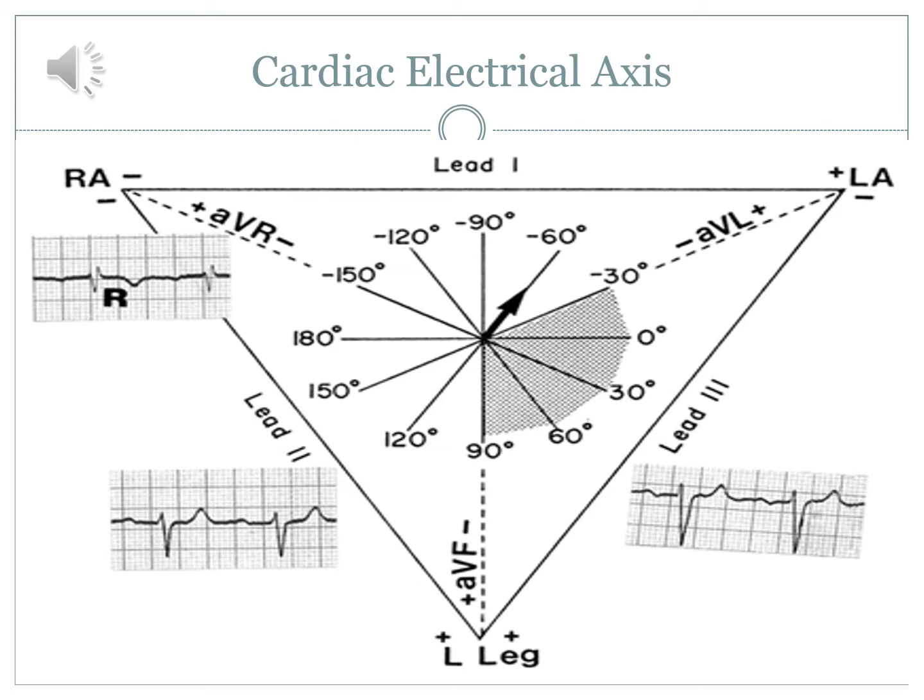Today we're going to look at electrical axis deviation. Now I completely understand that this is an area that most people try to avoid. There are people that have a general understanding. They describe the thumbs up, thumbs down methods, not really understanding what they're looking at with the heart or why we use certain values or what planes means versus leads. So hopefully today I'll illuminate the dark science of axis deviation and explain why certain things happen in the heart and why we look at an ECG a certain way in order to determine the area of travel.